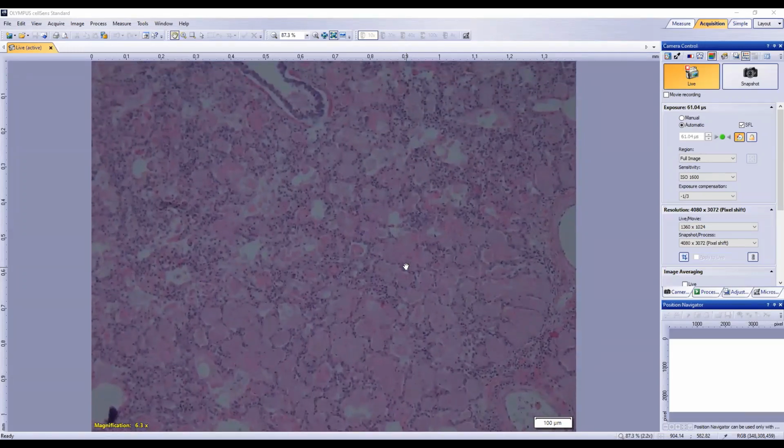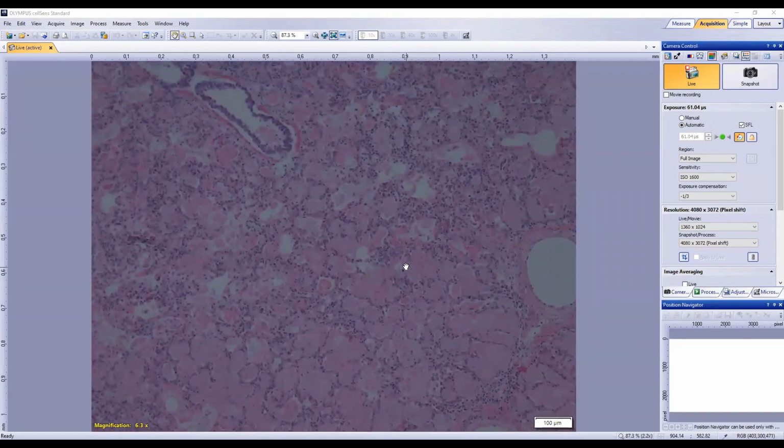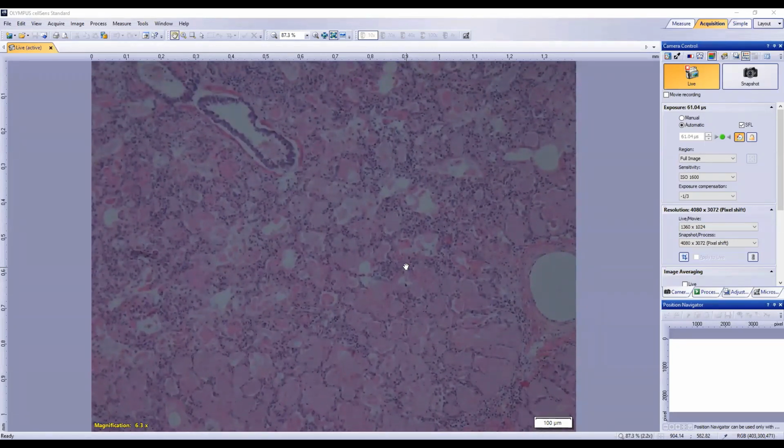Have you seen one? Oh, we see. Yeah, cool. So are these foals that have usually been associated with a difficult birth, and then have gone on to a Chlamydia psittaci associated, not abortion obviously, but an infection in utero, and have then gone on to develop pneumonia?